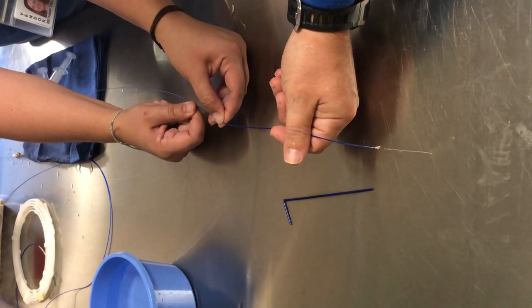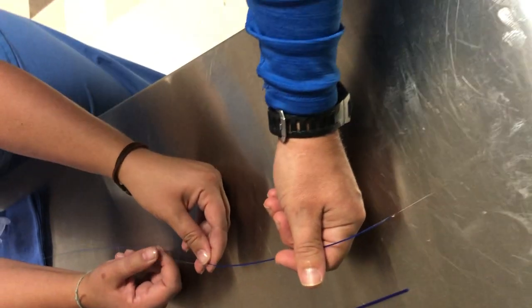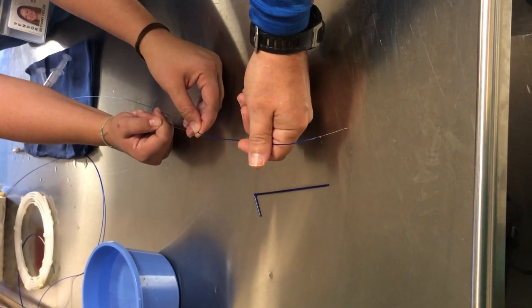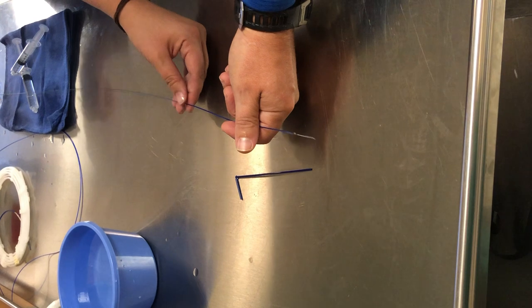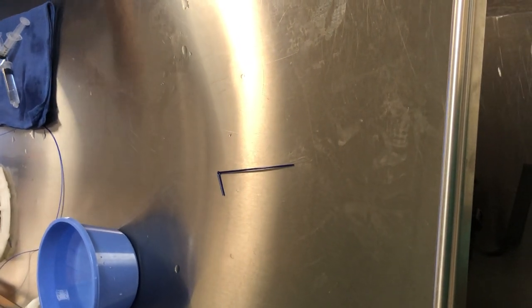This is all done within the catheter system. It's a very small movement — you're pulling on the wire, gently pushing on the retrieval sheath, and then everything comes out of the body as one system.